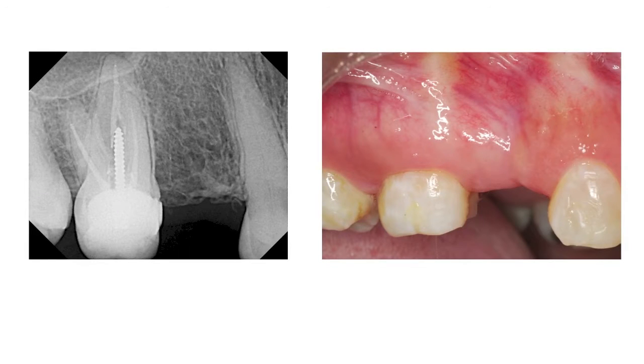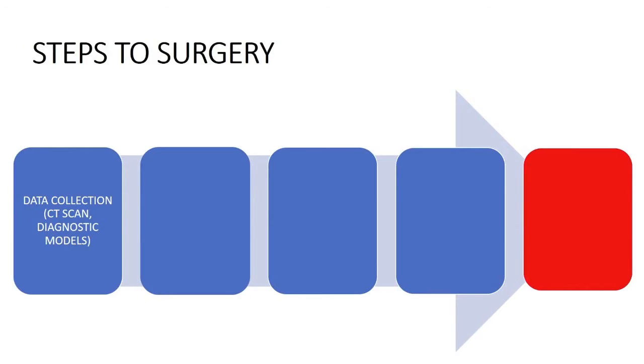So there it is, okay? Area, tooth number 5. A lot of bone. Someone may say, well, why would I even need a guide to do that? Hopefully when we finish, you'll have a better understanding in terms of doing that.